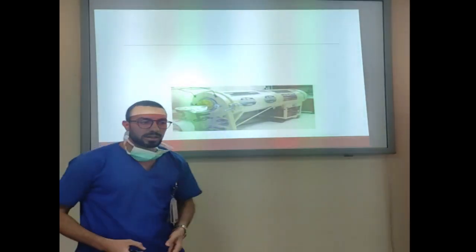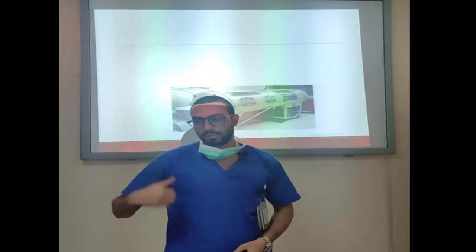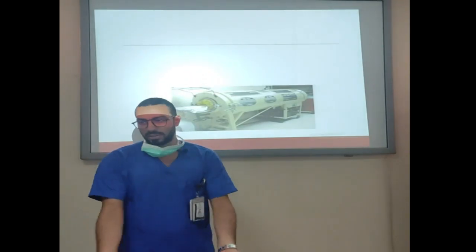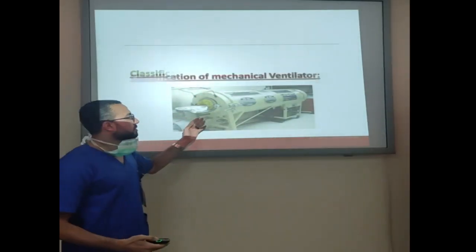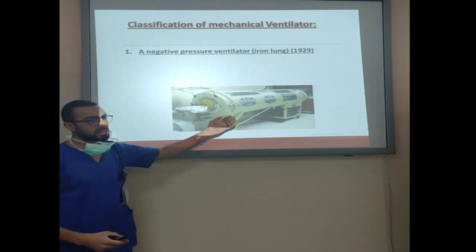So now we have two types of ventilators. One is old-fashioned and we don't use it these days, and the other one is the most common that we have in our hospital. The old one is the negative pressure ventilator. It's called the iron lung.